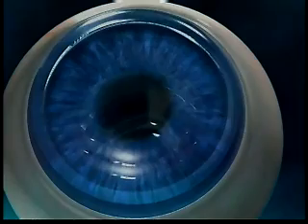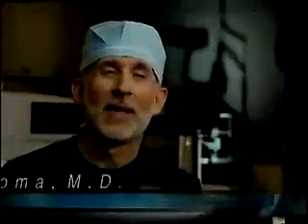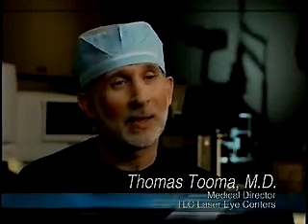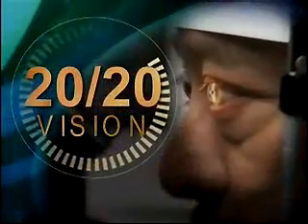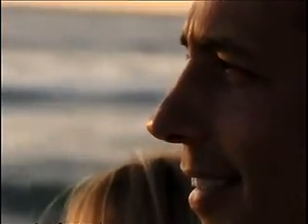Your doctor creates your corneal flap by gently separating the tissue where the bubbles have formed. The corneal flap is then folded back so the doctor can perform the second step of your corrective treatment. The IntraLase flap heals faster and stronger. Since we can tailor-make the flap for every patient, we can create a flap that allows us to preserve a lot more tissue so the eye is mechanically stronger. More patients in clinical studies achieved vision that was 20/20 or better when the LASIK procedure was performed with the IntraLase method, and patients report better quality of vision overall — particularly in terms of their ability to see well in low light, such as at dusk or at night.